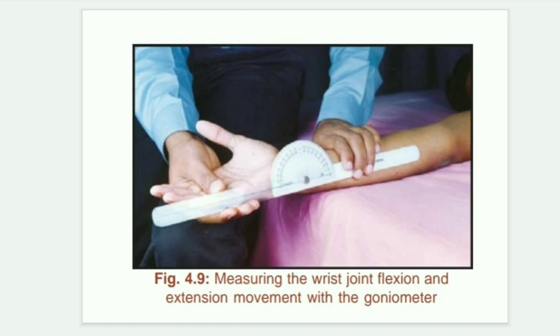The movable arm must be along the longitudinal axis of the fifth metacarpal — that is your wrist flexion. For wrist extension, the same procedure applies but the range is 0 to 70 degrees.